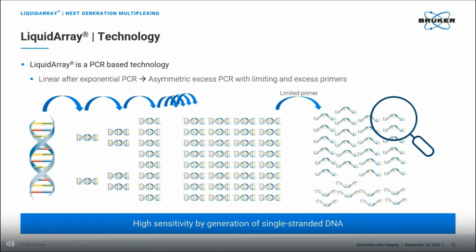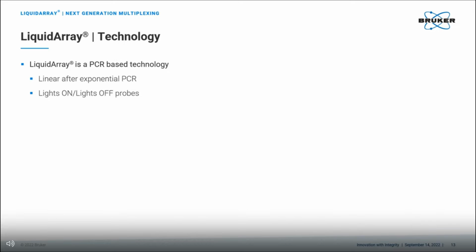Looking more closely then at the PCR product and how it is that we go about detecting that, we're using lights on and lights off probes. So using our lights on probe, we have a fluorophore and a quencher, and this I'm sure will be familiar to many of you, that when the fluorophore and quencher are kept far apart, such as when the probe is bound to a target piece of DNA, the fluorophore is able to fluoresce and be detected by an instrument. Whereas when the probe is not on the target strand of DNA, then the fluorophore and quencher come closer together and you no longer would see that fluorescence.